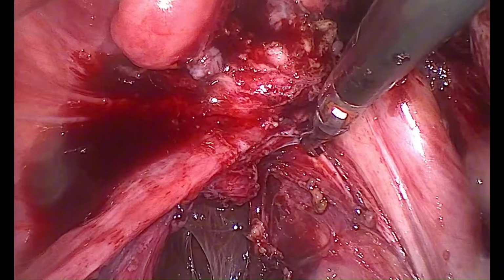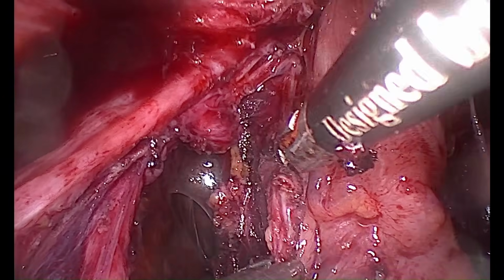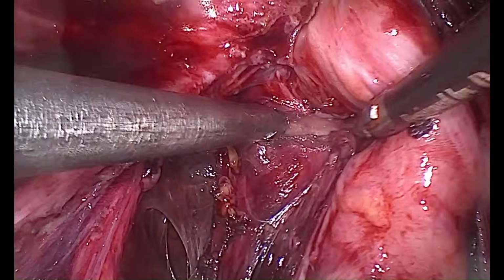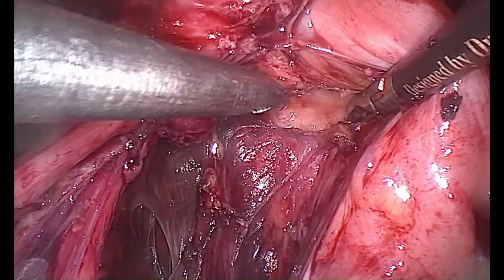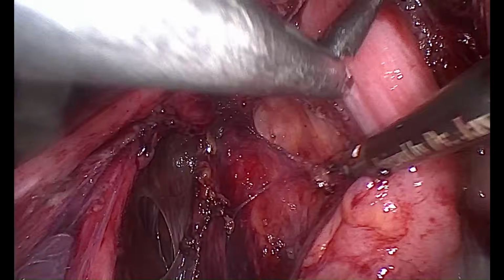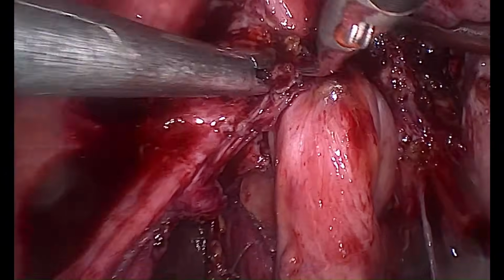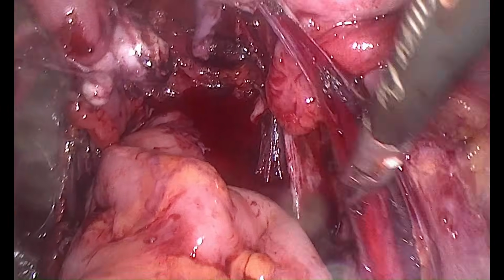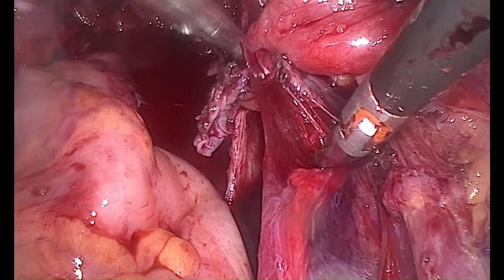This is the fat. Always you need to understand that the fat belongs to the vital structures. So if you are away from the fat, you are not going to cause damage to those particular structures in that dissection. You can see there is always a pivot joint wherein the rectum is going to get adherent, and I am now going to take a little bit of a judicious cut. You have to cut on this particular parametrium and get the dissection of the rectum done.